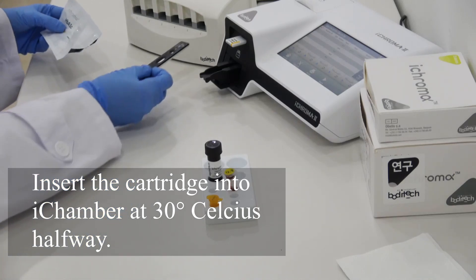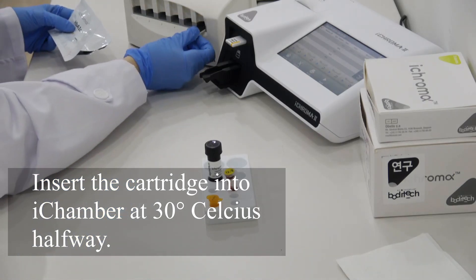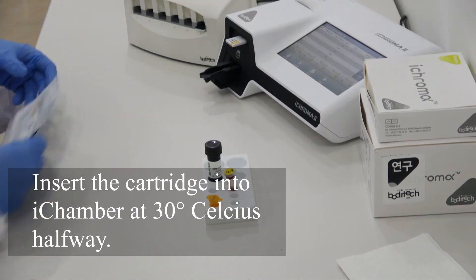Open the cartridge and insert it into a chamber set on 30 degrees Celsius without launching the timer.